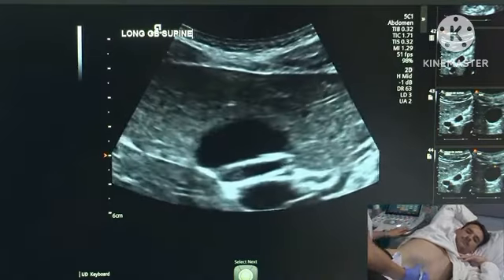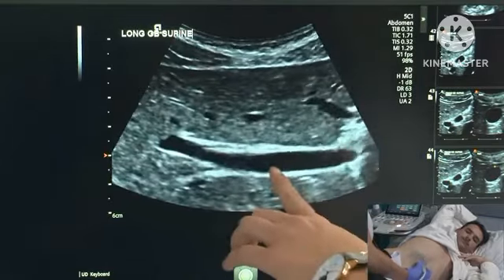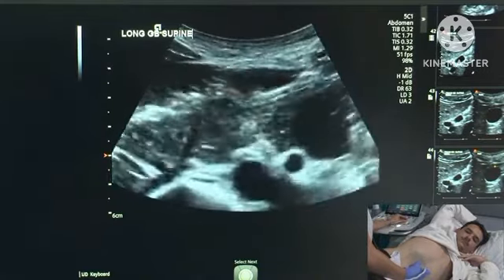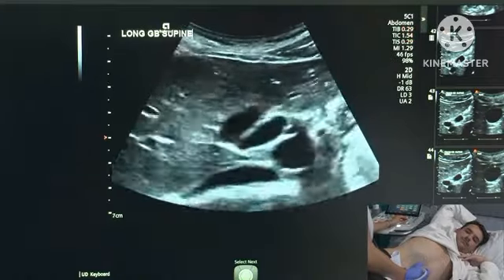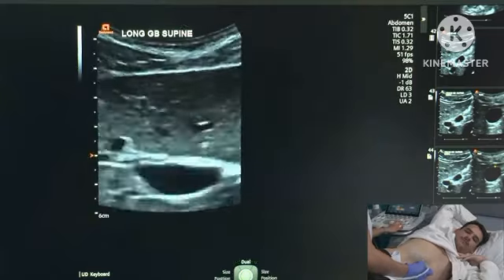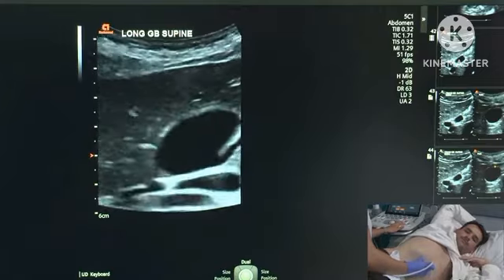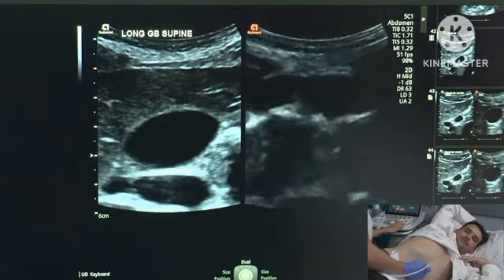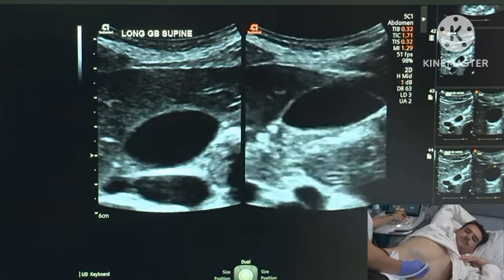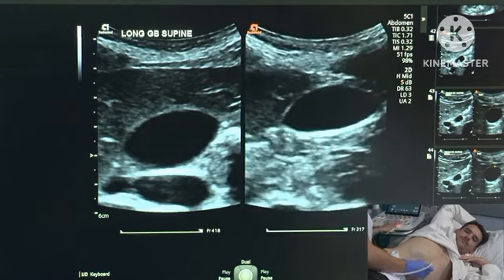And now I'm going to go in transverse, a big breath in, and I'm going to start superior to the gallbladder. So again, finding that portal vein, and I sweep all the way through, and I change my depth. Oh, this is as much as I can change it. And breathe. And now we can image us again, and we are going to do a dual screen. Big breath. We can go in transverse here of the neck, and we go all the way up towards the fundus, making sure that the liver does not appear as anechoic as the gallbladder. Breathe.